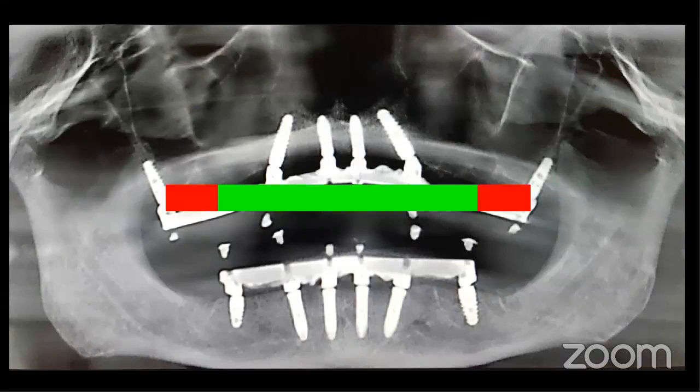Now, the other thing that's important is in designing the smile. Some patients have very high smile lines. Some patients have very wide smiles. And when they smile, you can see all the way back to their second molars. So in these patients, in your pre-surgical workup, that's one very important thing to look for: have the patient smile. And when we do a smile, we always do two types of smiles. We have them smile with a regular smile, and then we have them smile with a very exaggerated smile, because I want to see how much their lip moves. Some people, their lip can move very dramatically, and you can see all the way back. It's like they're pulling the curtain back. I always call it a Julia Roberts smile, where you can see everything.